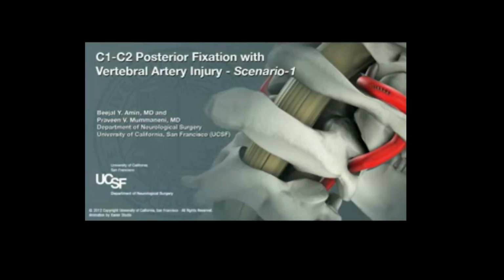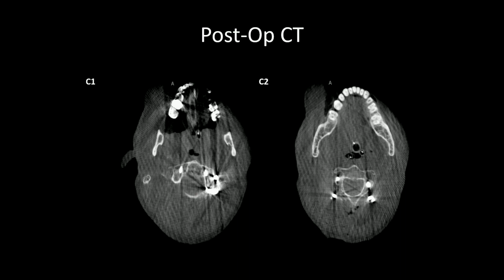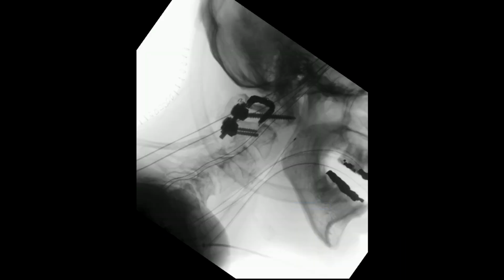Those are the key steps to not get all those strokes, because the bleeding may not cause a stroke. It might be the embolic material that you try to stick in there to get hemostasis. The first thing people want to do is grab for that Floseal and stuff it in there, and that's not the right thing to do. So, I revised it. You can see his coils there. He actually did go on to heal it.